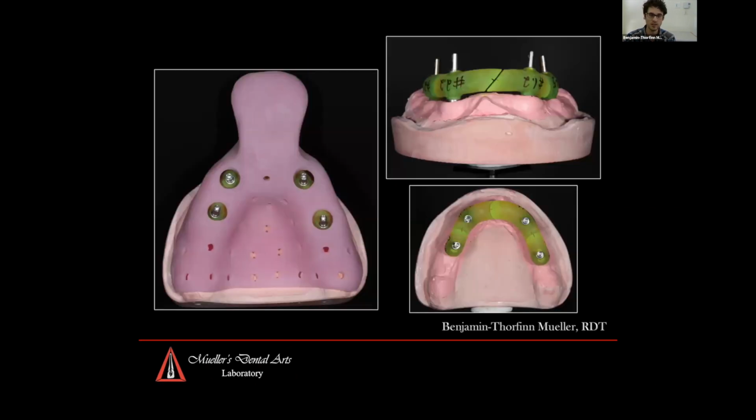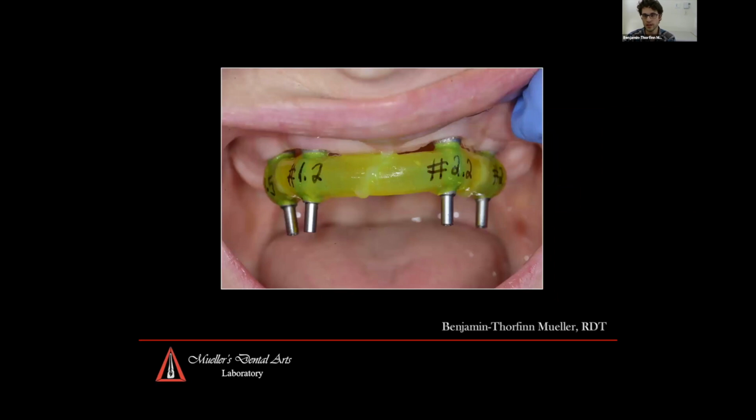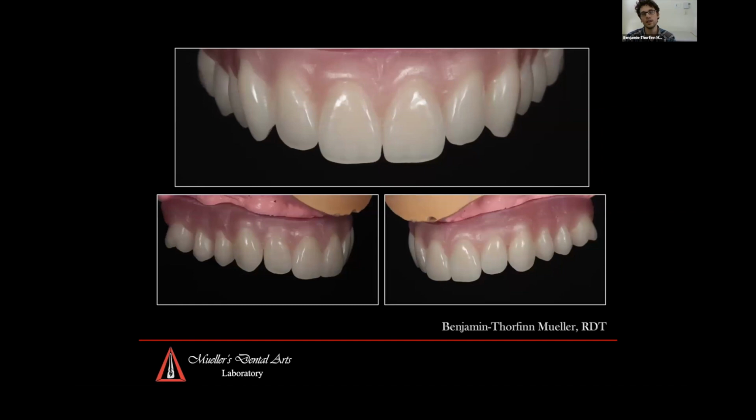Again, slow dentistry is best dentistry. First, a preliminary impression was taken to make a custom tray and a cut verification jig, which was then sent out to the clinician to lute together in the mouth. Over that, the custom tray was placed, and the final and verified impression was taken and then sent back to us so that we could make a diagnostic setup.